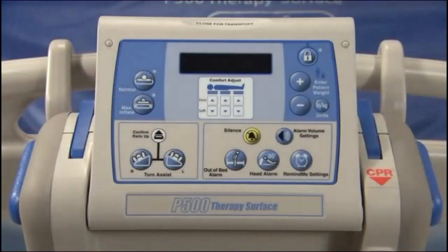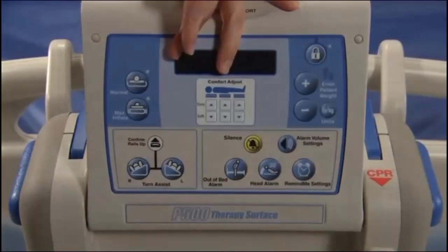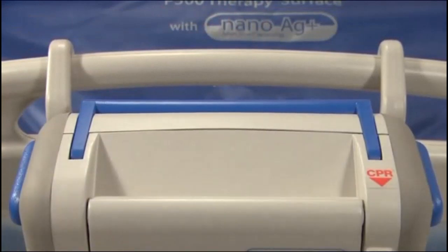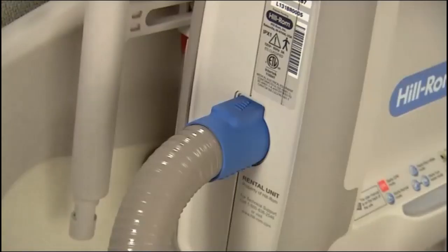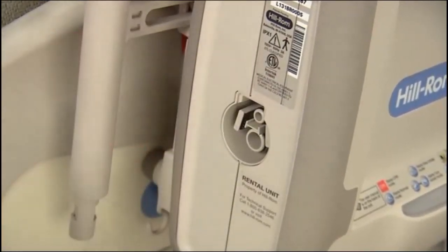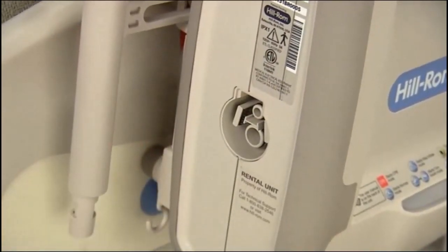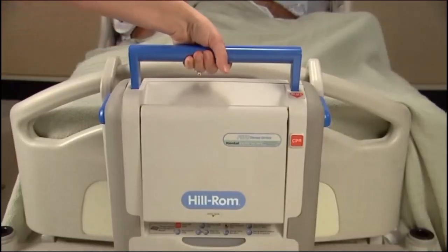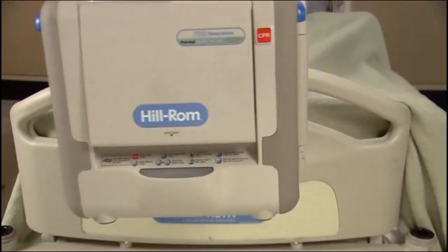The process to transport begins with turning the power switch off and disconnecting the control unit from the power source. Close the display panel on the control unit. Put the bed into transportation position. If the control unit and hose are to remain in the room, press the disconnect switch on the hose assembly. Remove the control unit and place the air control box, hose, and power cord in a safe place away from traffic.